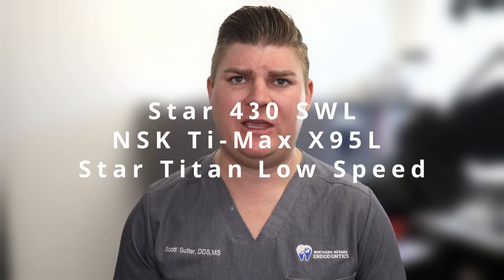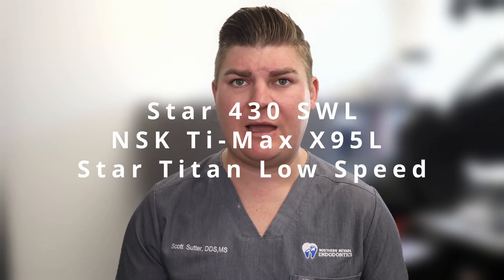One of the ways to make your practice run more efficiently and control your overhead is to do some of the maintenance yourself on broken equipment. I have three different types of dental handpieces that I use, and today I'm going to show you how to change out the turbine on a Star 430.